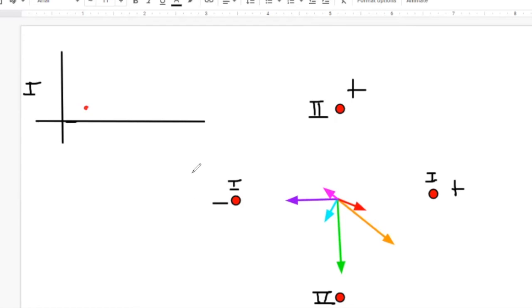And then what about when we go to orange? Still positive, still negative, or goes to negative? For lead 1. Lindsay, you're nodding yes, still positive. Higher positive or lower positive? Higher. Why do you say that? Because it's more in the horizontal direction. Right, so the magnitude after projection is higher than it was during the red. If you take this orange vector and project it, it's a longer projection than when we did the red one. So it's going to go up.